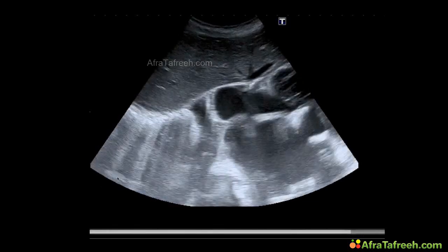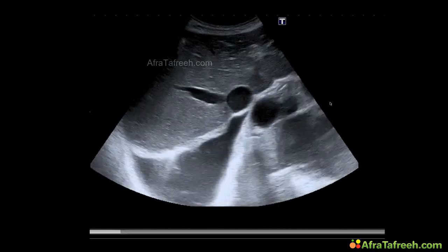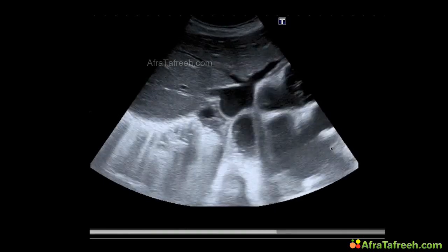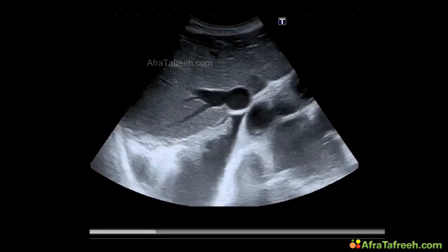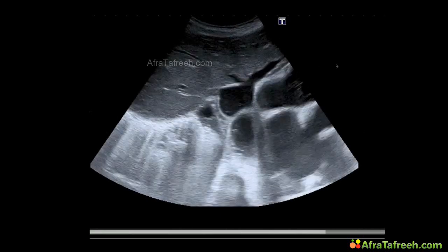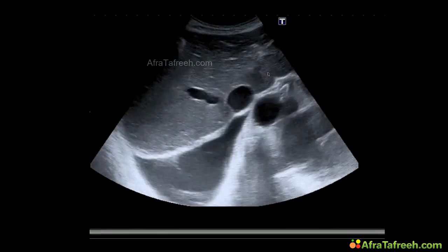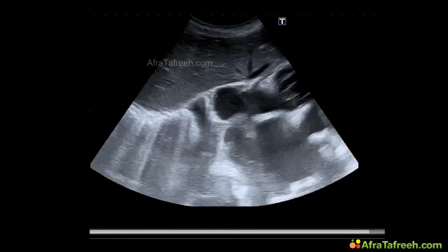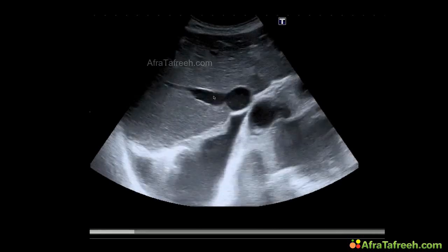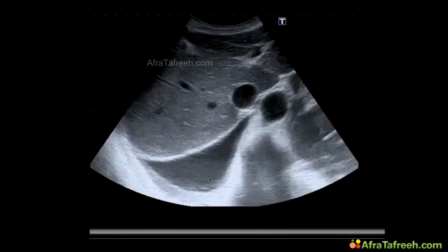The same in this video over here, and you can also see the heart pumping. But we can't take a glimpse of heart function now because this is a plane of the liver and we could not possibly judge the right heart function over here. But again, the widened confluence of the liver veins, plump liver veins too, and this pleural effusion.